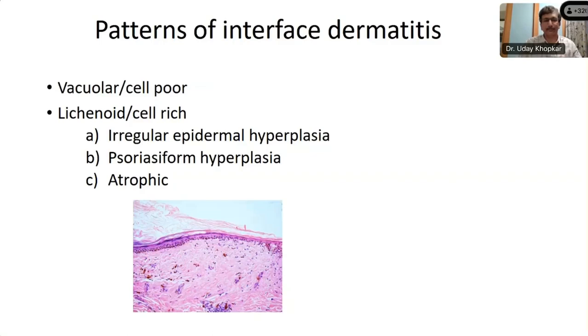In case of this lichenoid type of eruption, one should know about the drug history. So what are the common drugs which can lead to this type of changes? History is very important, like which type of antihypertensive the patient is taking or not, or beta blockers. These history we have to know, so whether the patient is on a drug or this is actually lichen planus, not due to drug reaction.